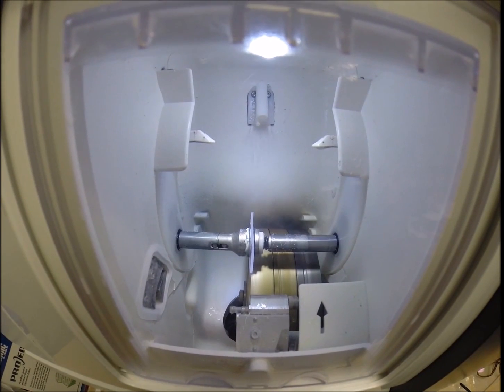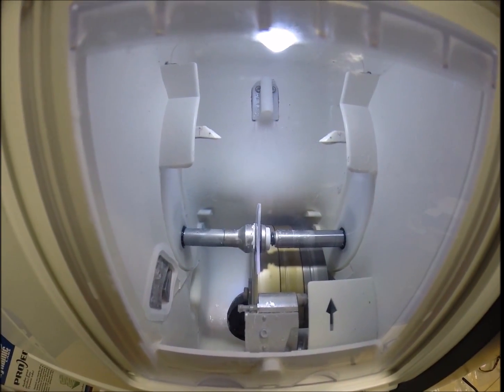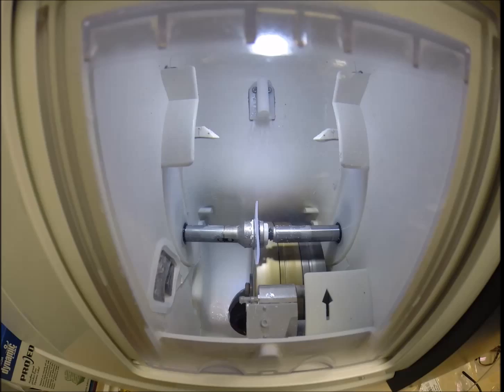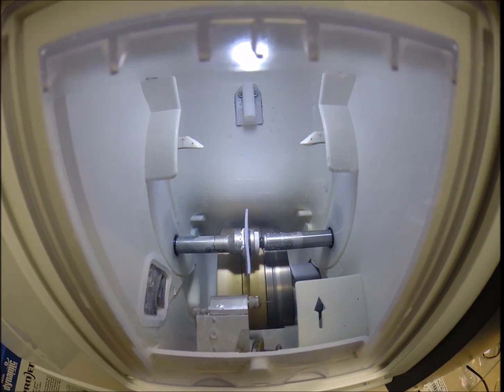Polycarbonate lenses cut dry, where plastic, high-index plastic, and Trivex cut wet, meaning that water sprays onto the lens for the duration of the cutting cycle. Now, water will spray onto this lens for the last 20 seconds just to wash away any optical debris that may be on the edge of your lenses.